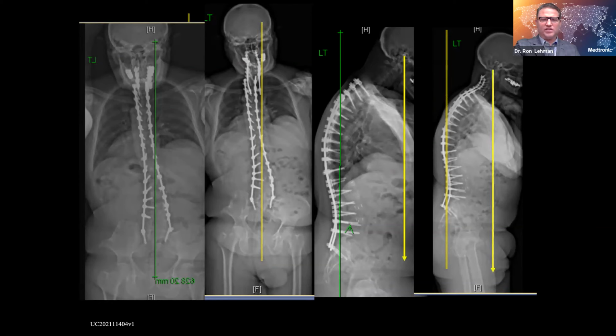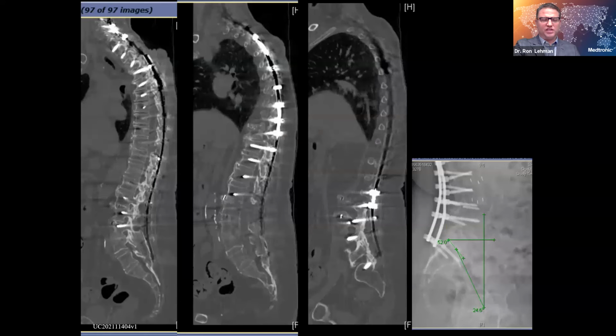So from that perspective, we decided to do his lumbar reconstruction, and looking at his CT scans, once again, we can see that he really is pretty solidly fused, at least posteriorly, and has multiple ALIF operations done, has some disc spaces down here, which are potentially targets of opportunity, but he has solid posterior fusion mass and has Bertolotti's here at L5-S1.